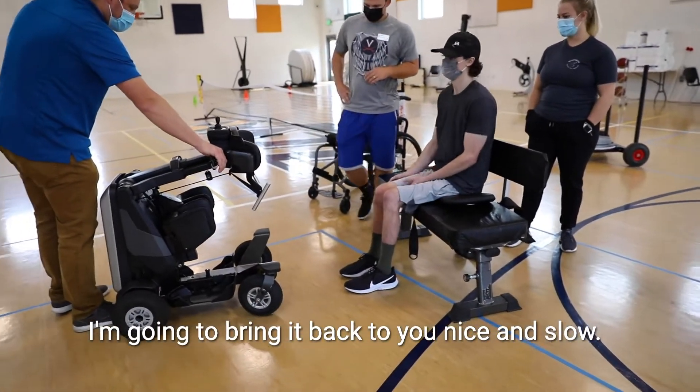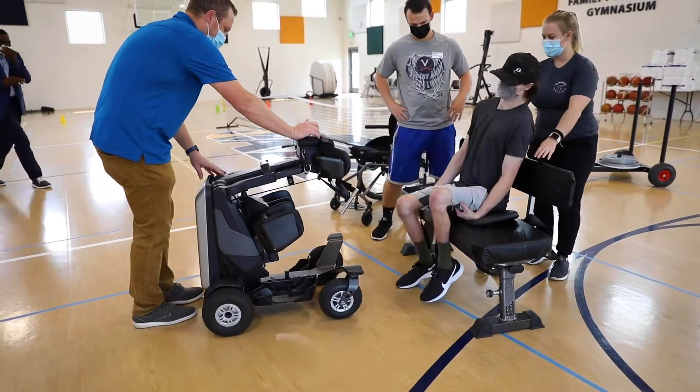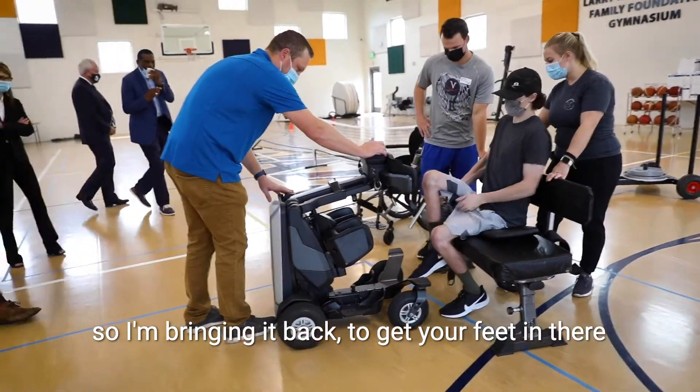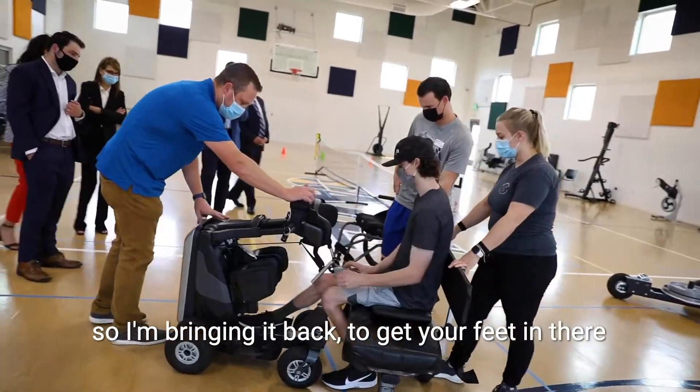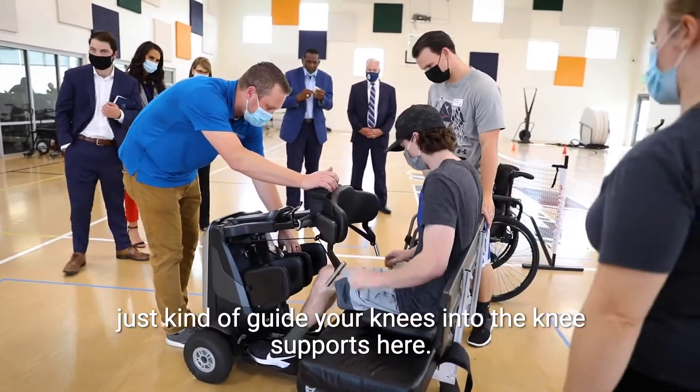So I'm going to bring it back to you nice and slow. As I bring it back, you just want to get your feet in there, a little bit nice and slow, and then just kind of guide your knees into the knee supports here.